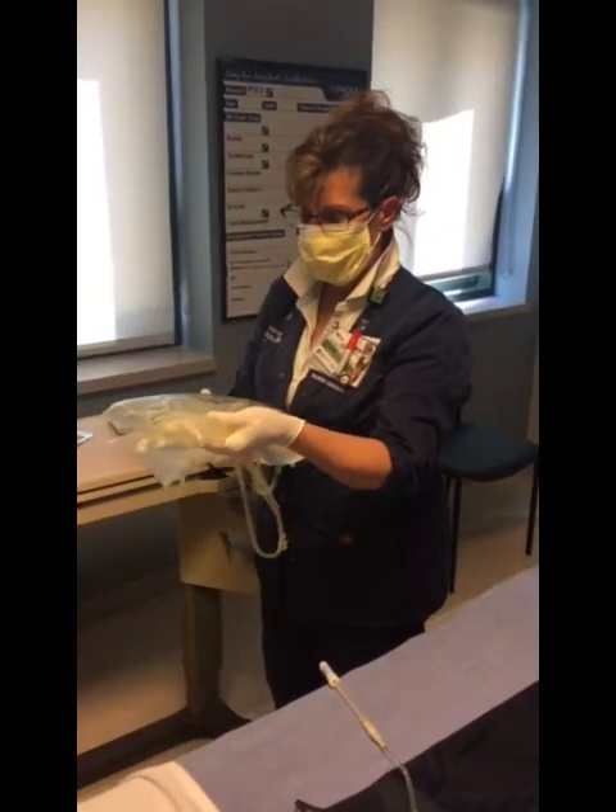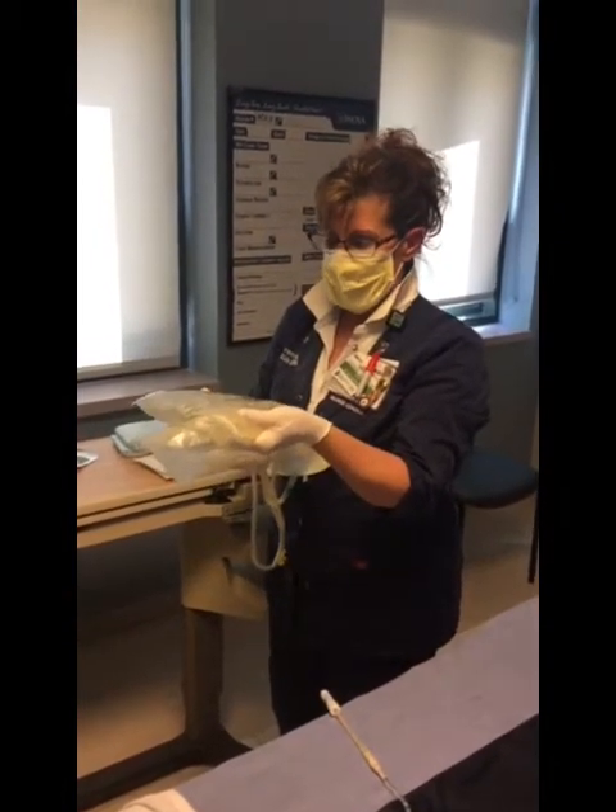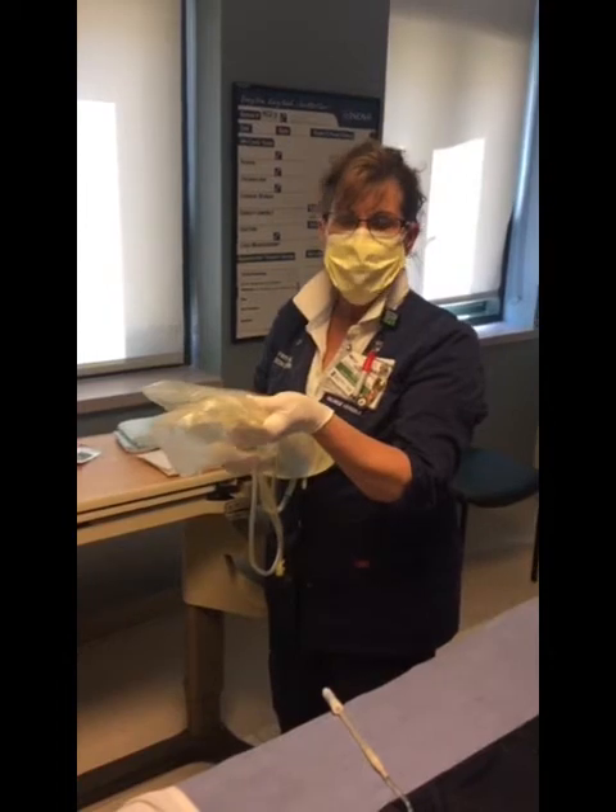First, we're going to start by closing off the room. A sign will go on the outside saying do not enter. I'm going to wash my hands, then place a mask on myself and the patient, and get my supplies ready. After reviewing the orders for the particular dialysis solution, they will be kept in a warmer on the outside of the room.